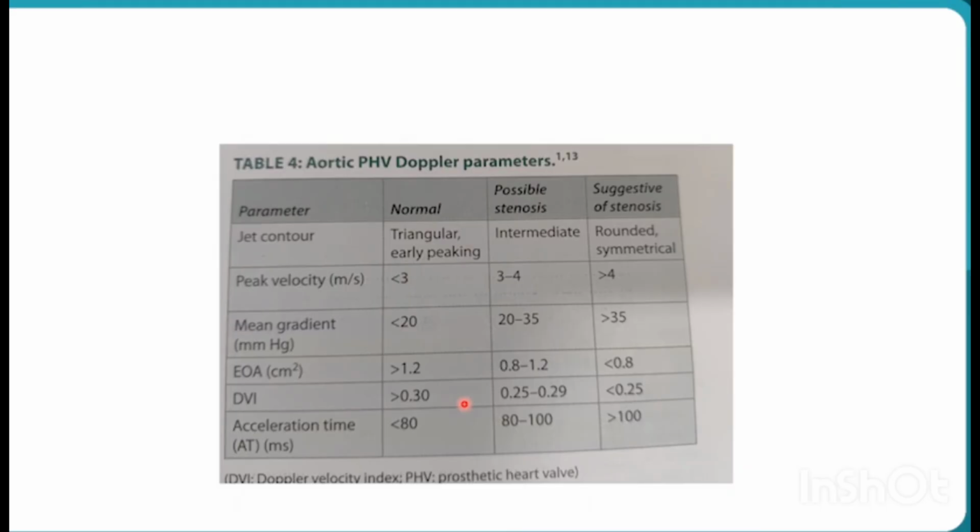However, having studied all of this, there has to be a flow chart to assess how to go about it, starting from clinical, whether to go with cinefluoroscopy directly, in a setting where cinefluoroscopy is not easily available. So how should we go about assessing the aortic heart valve?